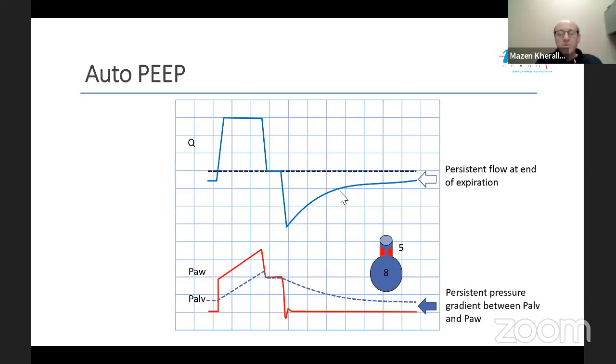Well, I need 15 minutes to understand the question, and then probably another 15 minutes to answer it. So okay. You explain if we add external PEEP on the patient with volume control ventilation, but in pressure targeted ventilation, adding additional PEEP beyond auto-PEEP will not increase tidal volume. Well, in both cases it will not increase tidal volume.